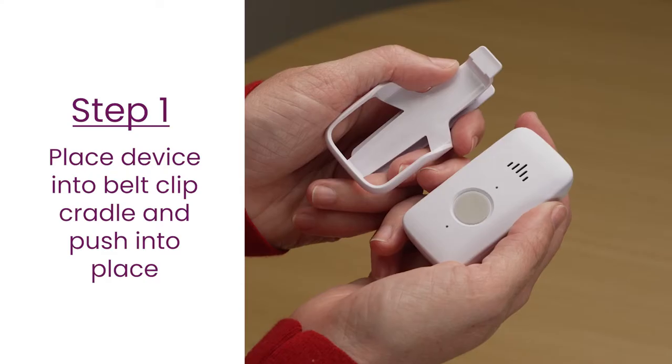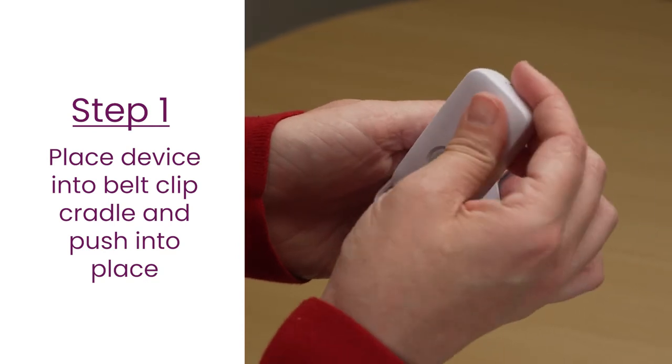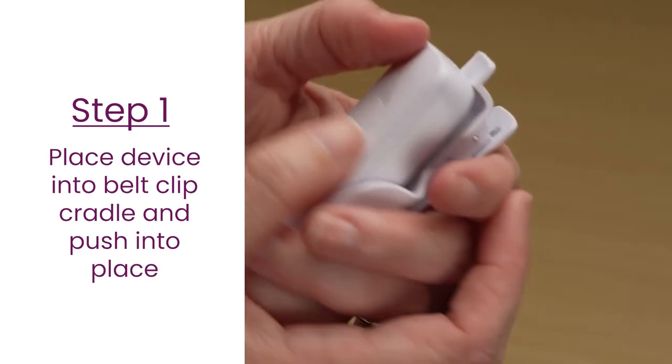With the belt clip in one hand, place the device into the belt clip cradle and push until you hear the device click into place.